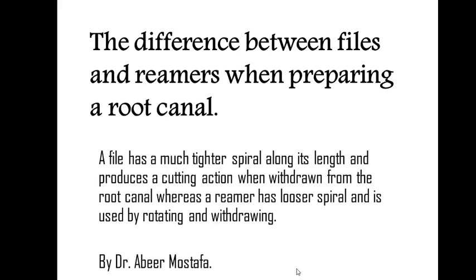Today we're going to talk about the difference between files and reamers. Then we're going to talk about the criteria for obturating a root canal, and then the features of an ideal root canal filling material. And finally, the techniques that obturate a root canal with this material. Okay, let's start with the difference between files and reamers when preparing a root canal.